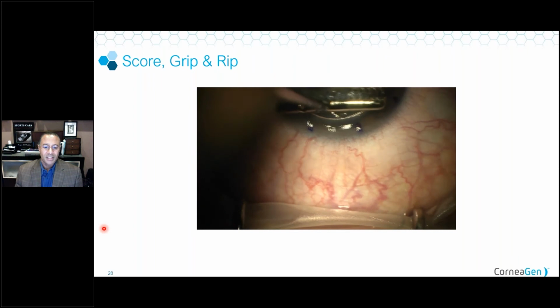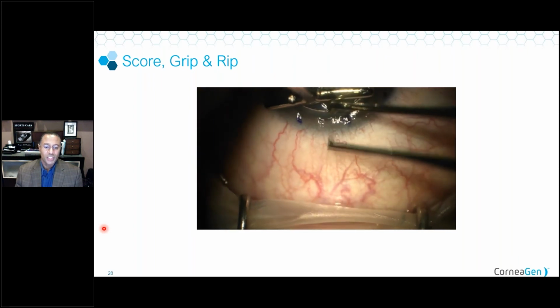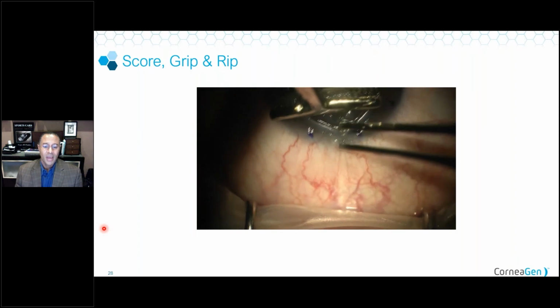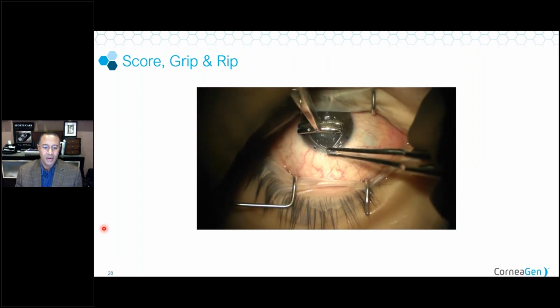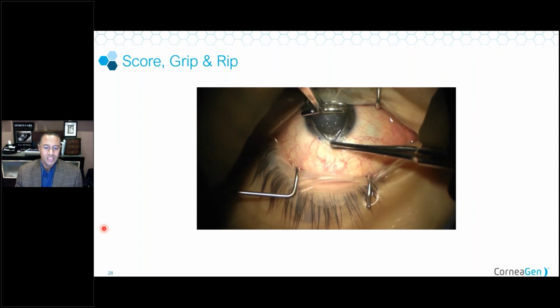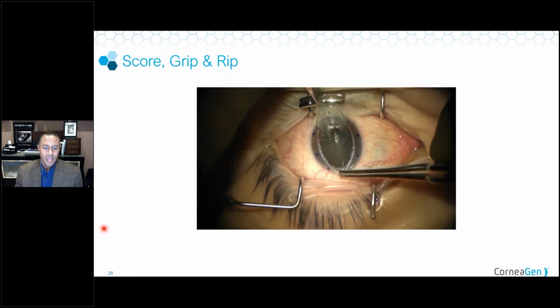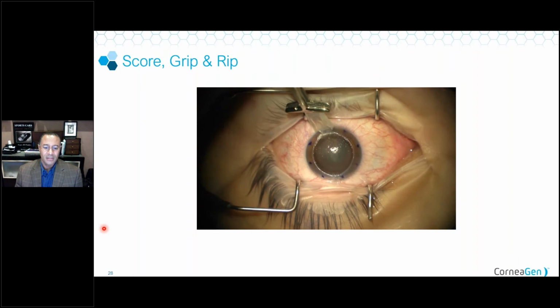We then basically reflect that back. We use the bishop forceps again to have another heavy forceps on our rim. And we're going to pull in the plane of the iris. We're not pulling up towards the microscope. We're pulling down towards the patient's feet. And as we do that, you'll gradually see the cornea will release, and we'll get a smooth pull all the way down to the 6 o'clock position.